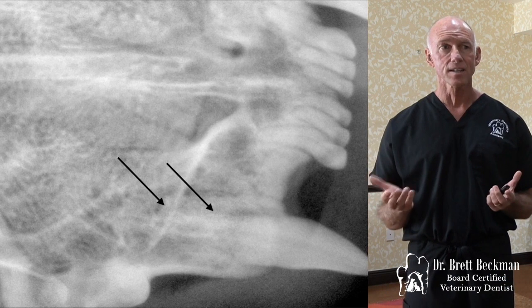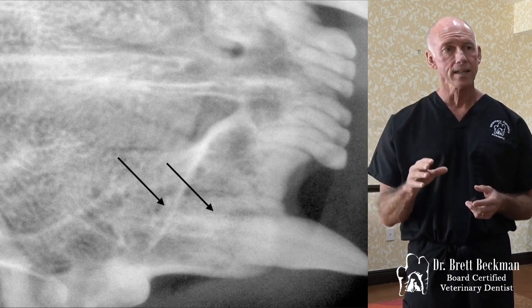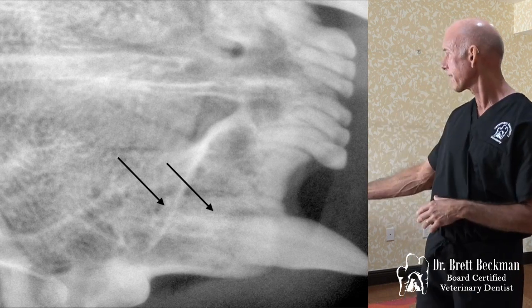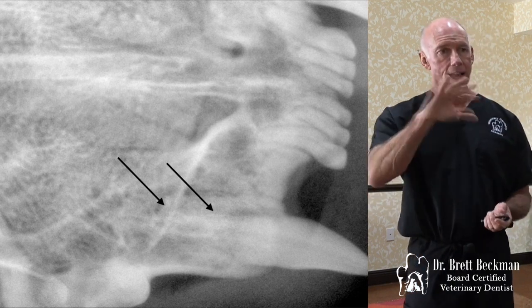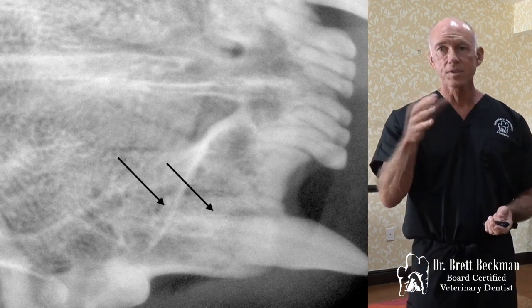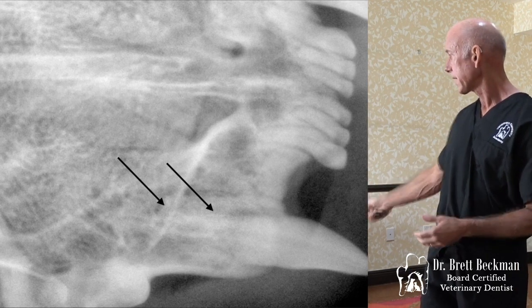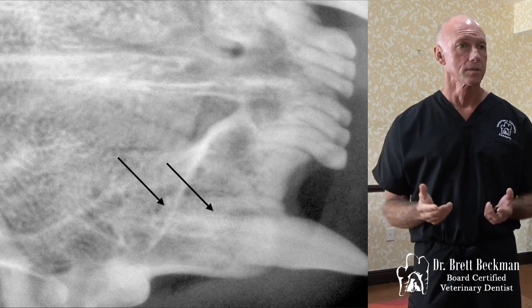It's just as easy to go up there and take that bone off and see what that tooth root looks like, and either extract the whole thing or say, well, right here I can see the line of demarcation in my lateral approach, so I'm just going to take this part where that front arrow is, and then the rest of it I'm just going to smooth the top of it, and then I'm going to close.